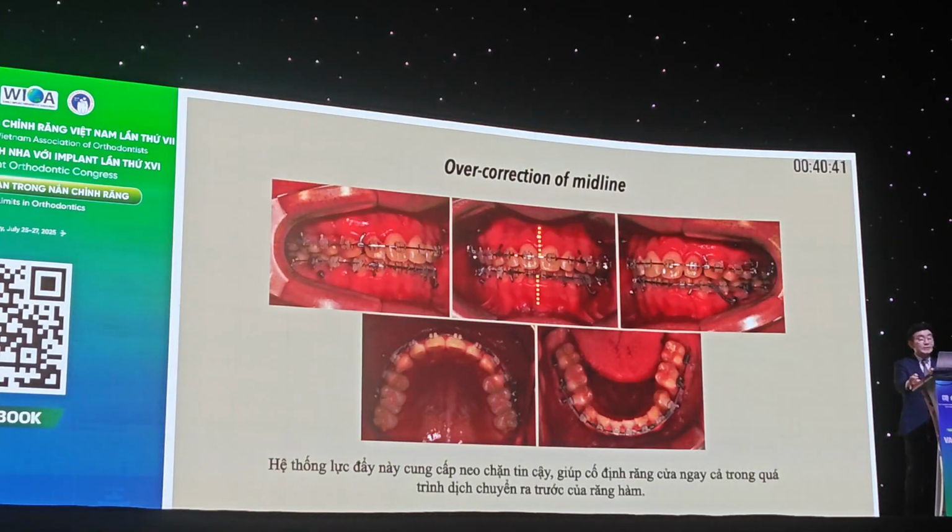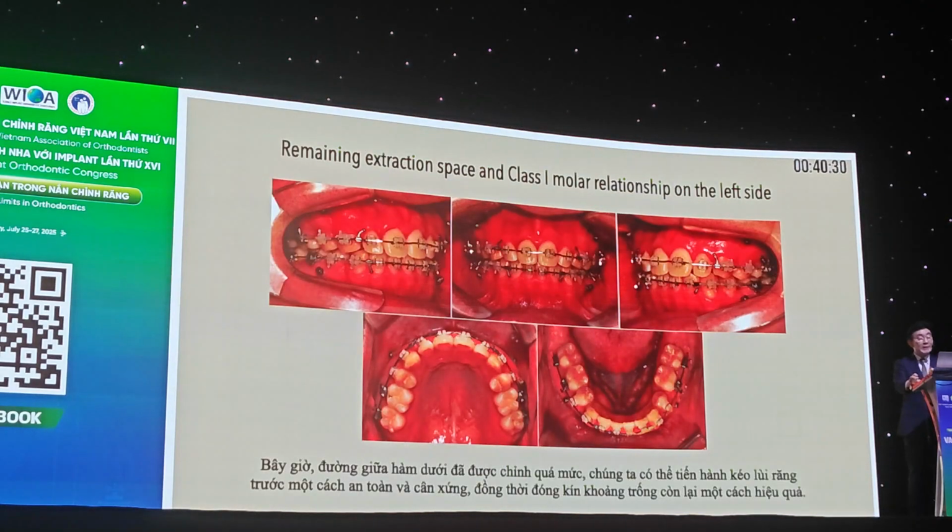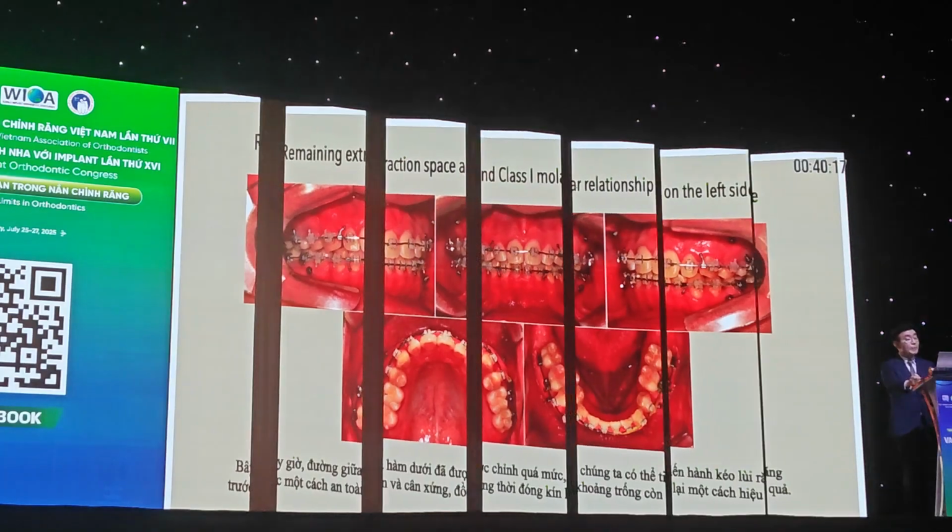This pushing force system provides reliable anchorage, stabilizing the incisors even during the forward movement of the molars. Now that the mandibular midline has been overcorrected, we can proceed with safely retracting the incisor teeth symmetrically while efficiently closing the remaining space.